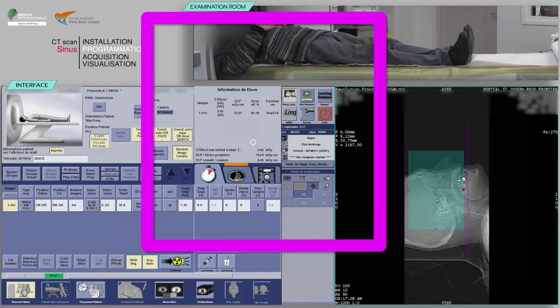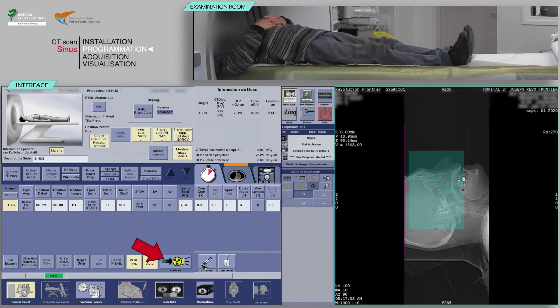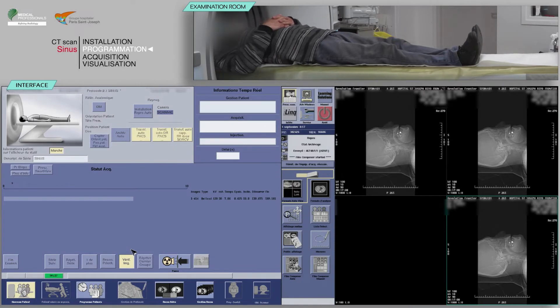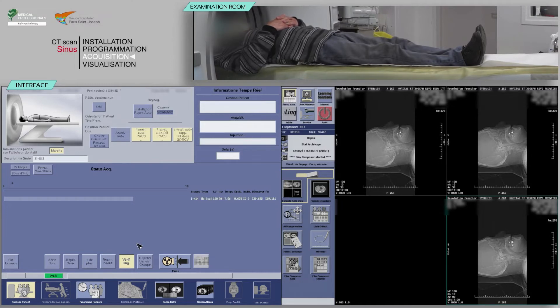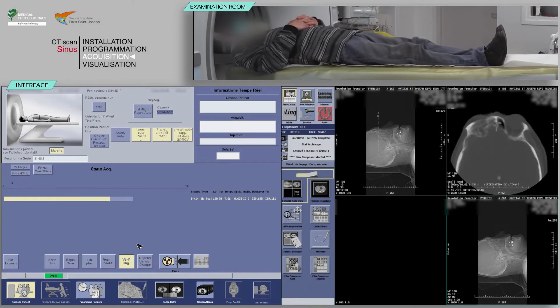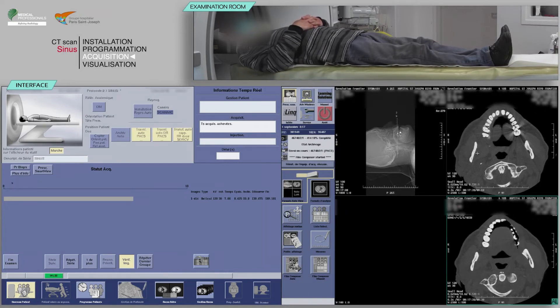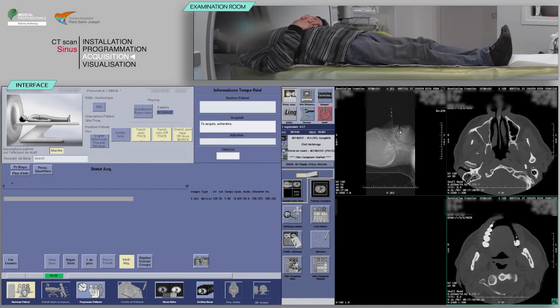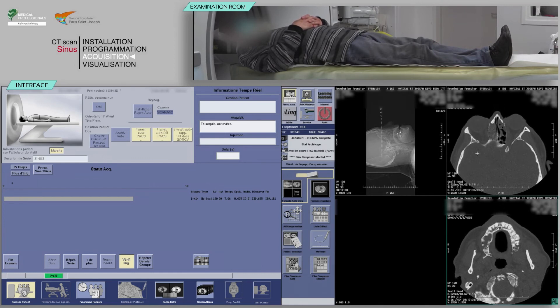Before continuing, check that the predicted dose is consistent with the diagnostic guideline values. Press on Confirm. On the keyboard, move the table and proceed with the acquisition when the buttons are flashing.